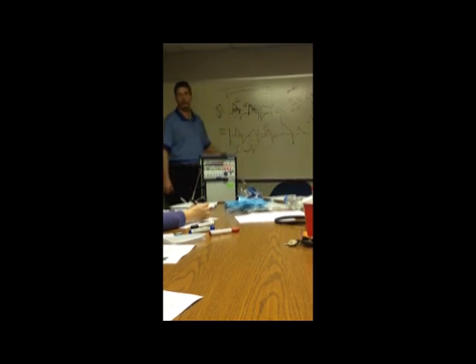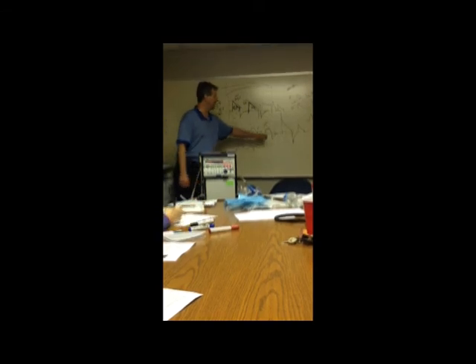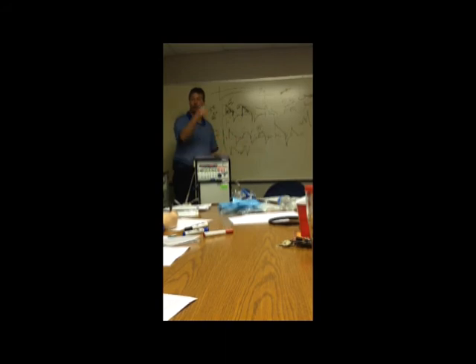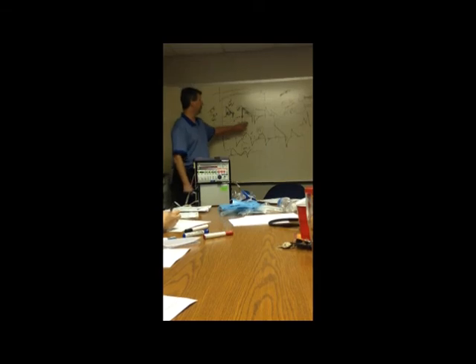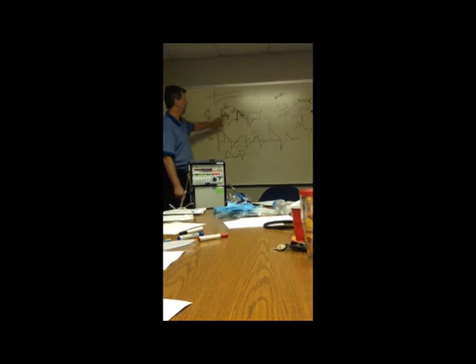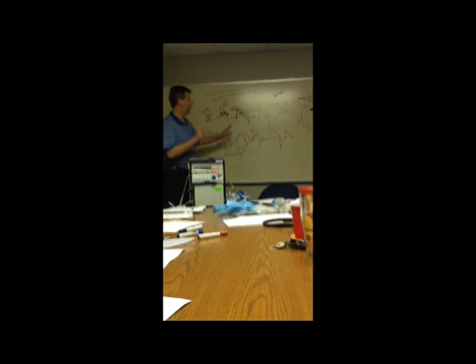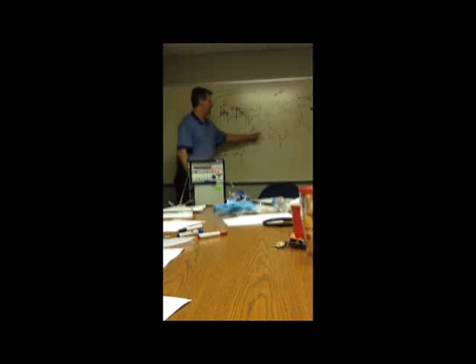Air-hungry patients, get them off this, get them on this. Okay, that'll fix most of them. And start with the same settings you had in this. Say if they're on IMV of 8, put them on this or assist control of 8. Even if they're breathing 20, now they'll be breathing 20 with these smaller ones in between now bigger. That'll slow their rate and get them comfortable. To make people comfortable breathing, you got to satisfy their oxygen, you got to satisfy their CO2. Increasing their spontaneous efforts without them having to increase the work drops their CO2, and they work less, they feel better.